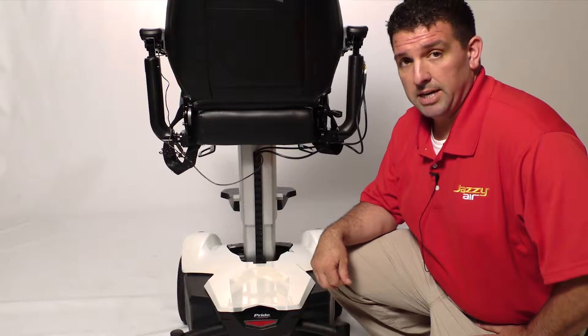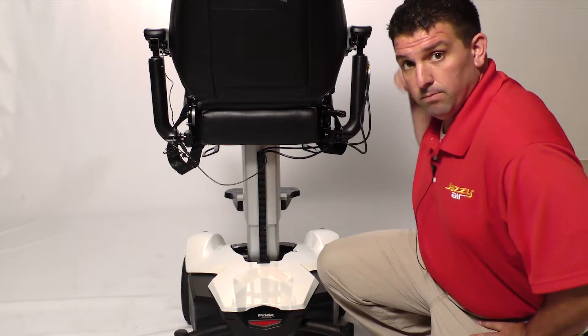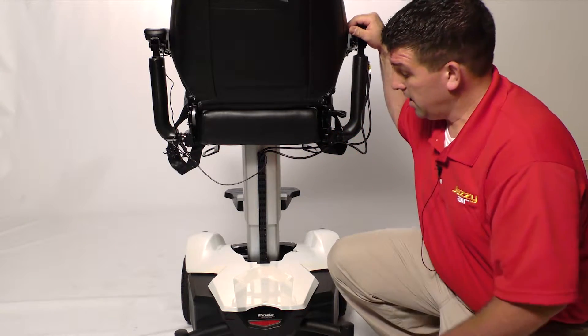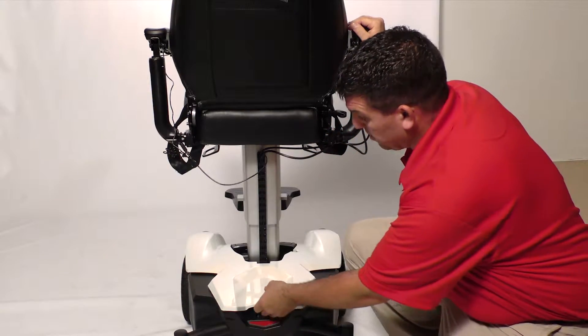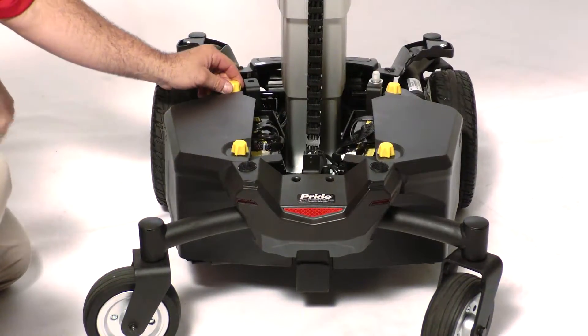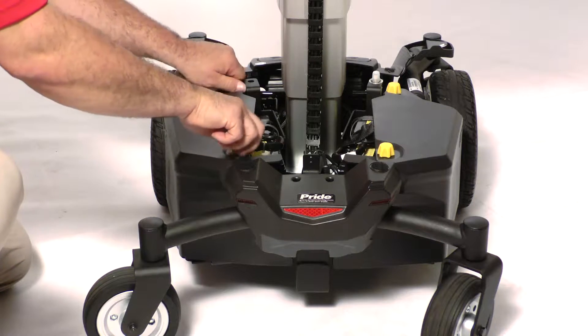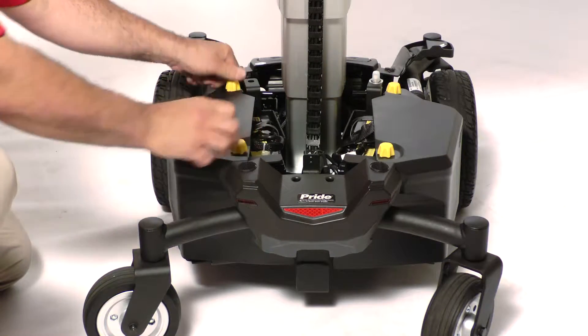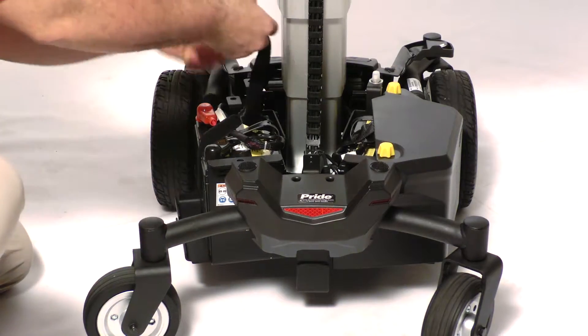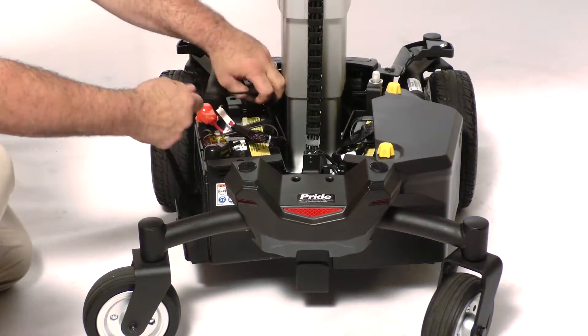For the removal of the Jazzy Air joystick, you need to make sure that your Jazzy Air is in its fullest upright position. Pull your shroud off, remove your left battery by unscrewing the battery box and unstrapping the battery.